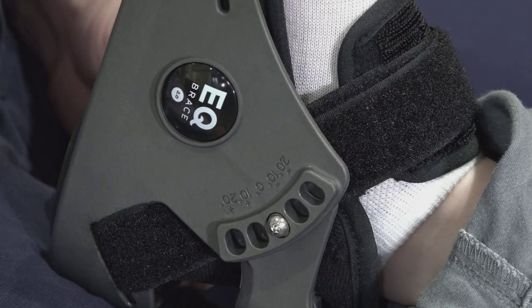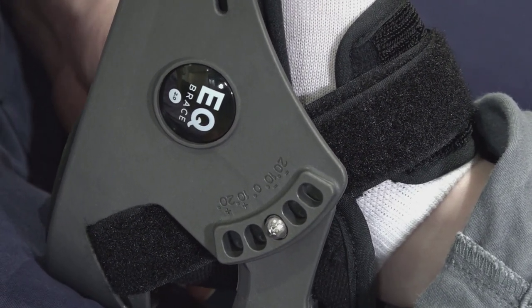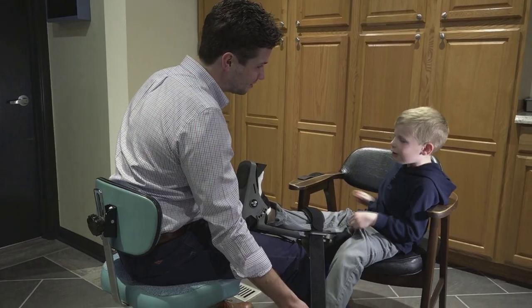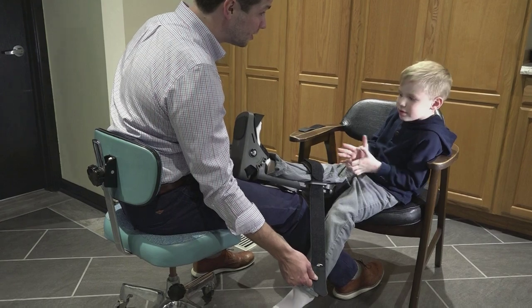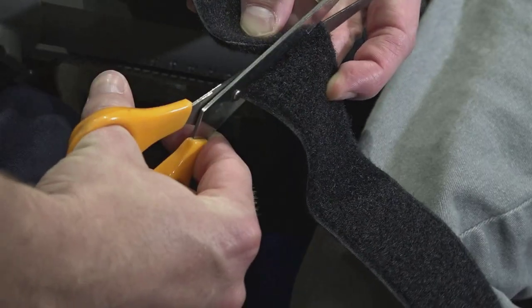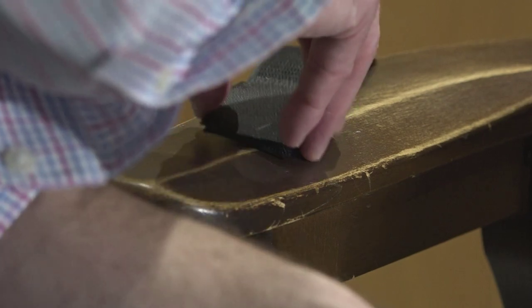If the patient has a smaller shoe size than a women's size 6, we recommend our pediatric brace. This brace is very similar to the adult size; however, it also features a plantar flexion setting on the hinges to accommodate for more extreme contractures. Depending on the age of the patient, mom or dad might need to help. The straps on the pediatric brace can also be modified to fit smaller patients.